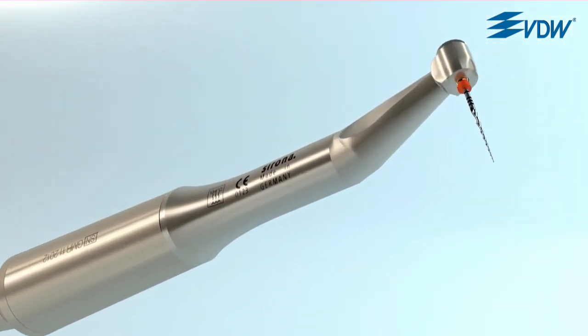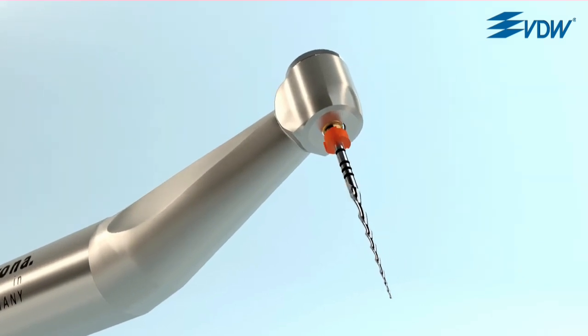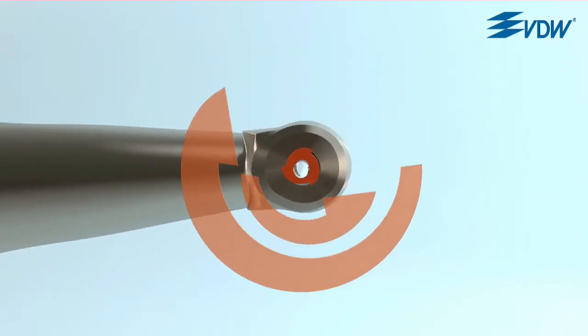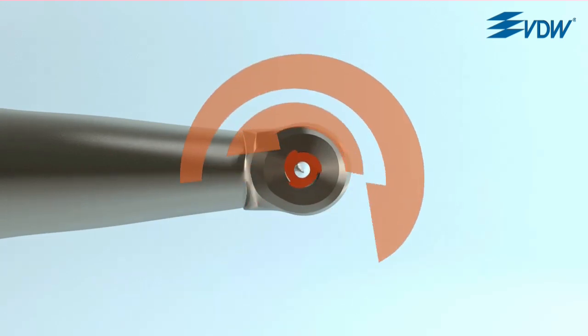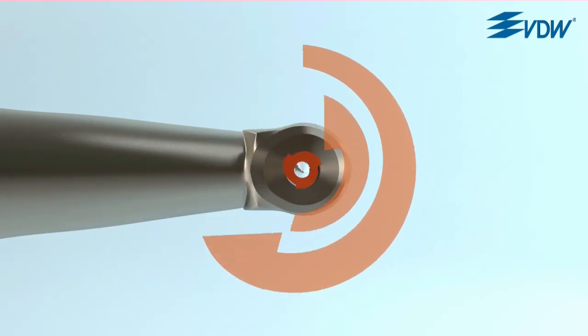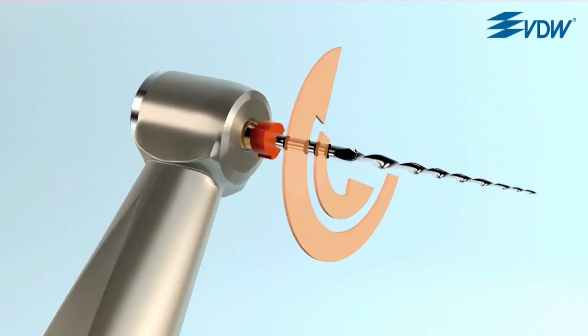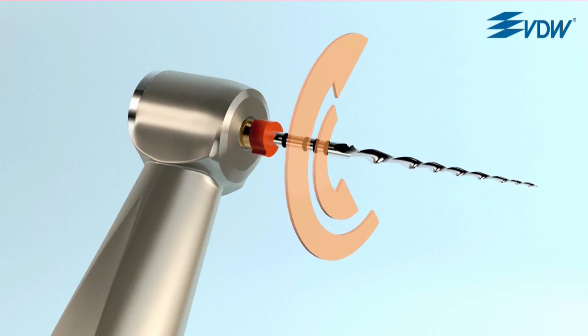The answer is in the unique reciprocating movement. The instrument alternates between clockwise and counterclockwise rotation. Due to the fact that the rotation in the cutting direction is larger than the reverse rotation, the instrument advances towards the apex.